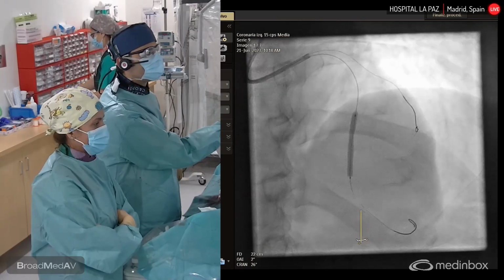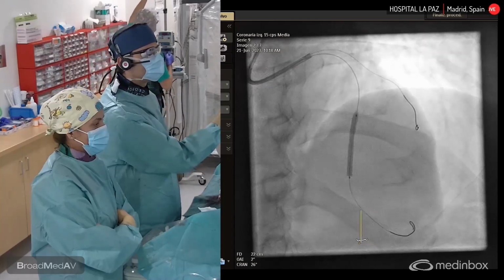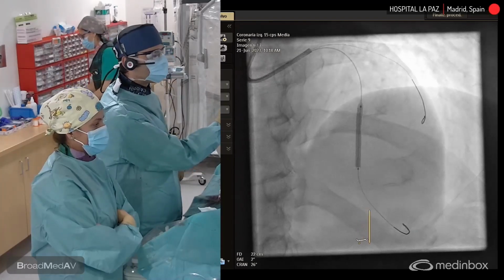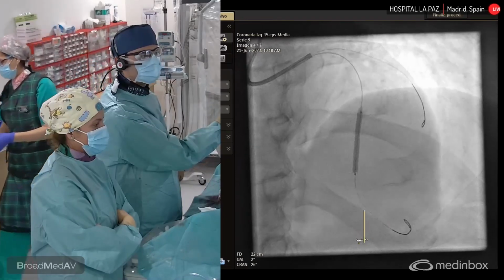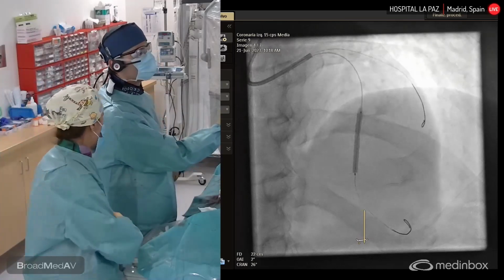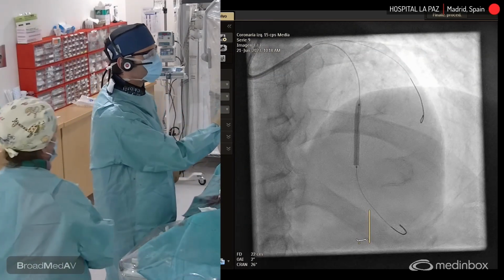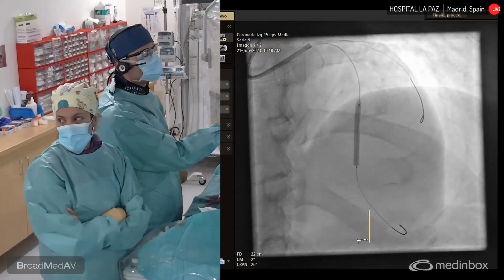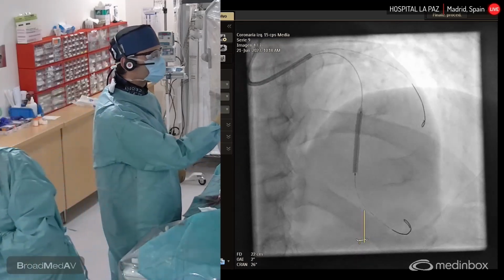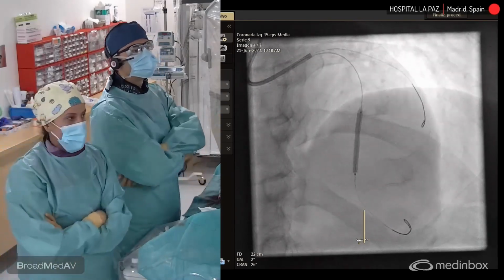This is the stent that, in this case, the patient was randomized to the synergy arm. So this is a 2.5 by 28. And you can see this is a nice expansion, but after doing the IVUS, Borja, can you show the second pullback of the IVUS? Okay, play.